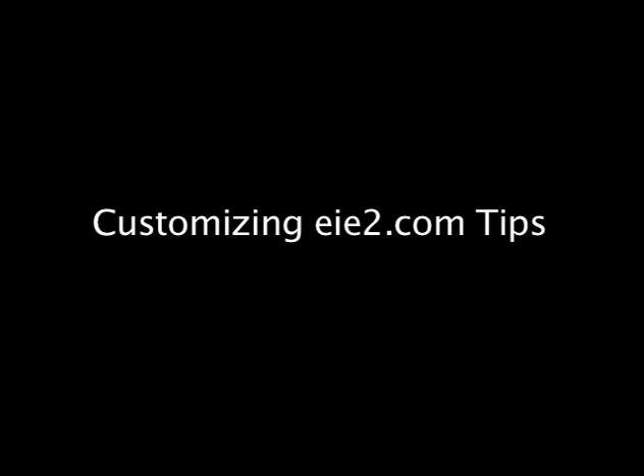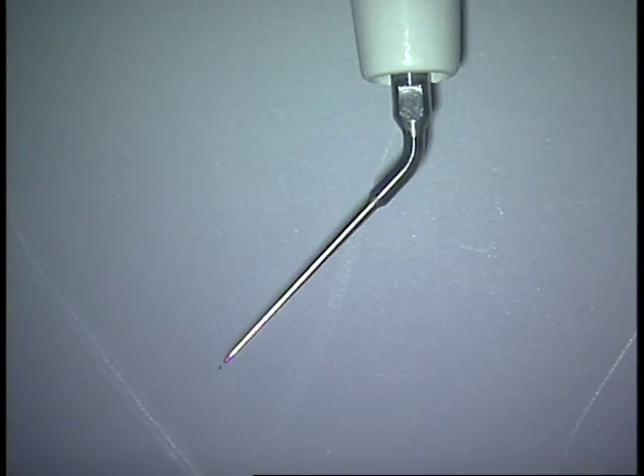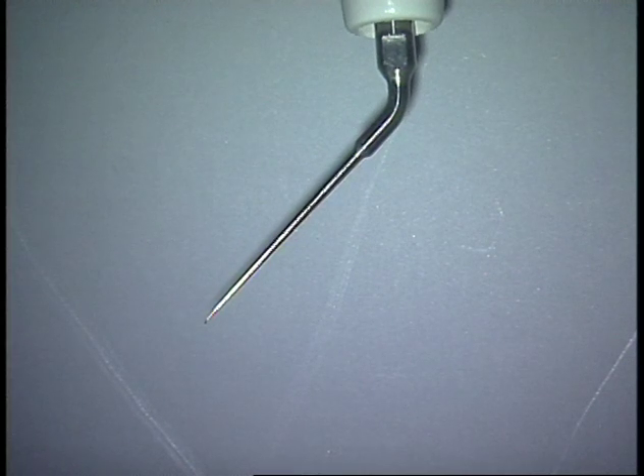All EIE2 tips purchased after January 1st can now be customized in this way without fear of breaking the tip. For example, this is your standard SP1 ultrasonic tip.